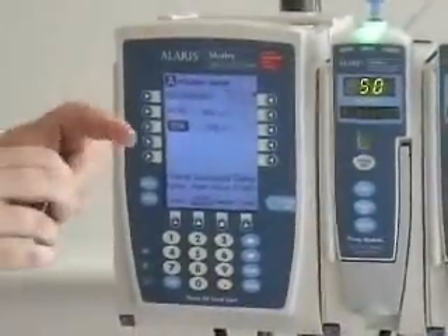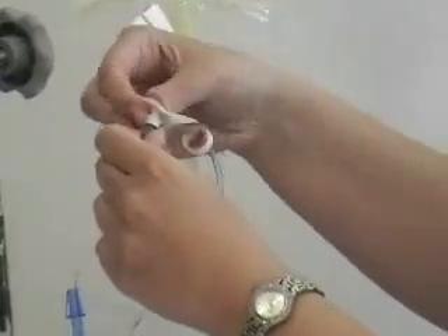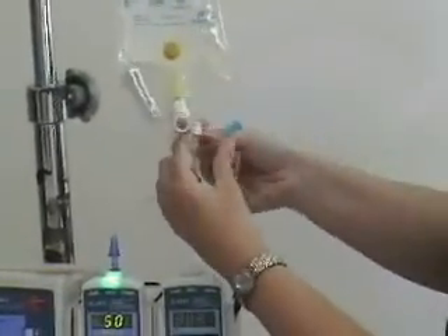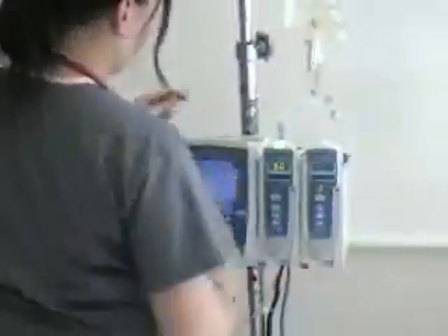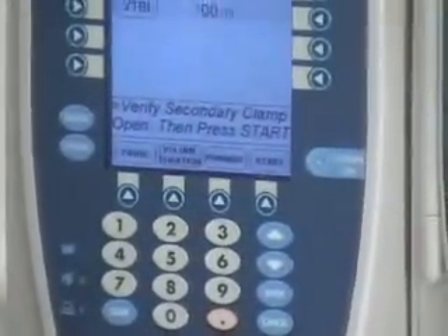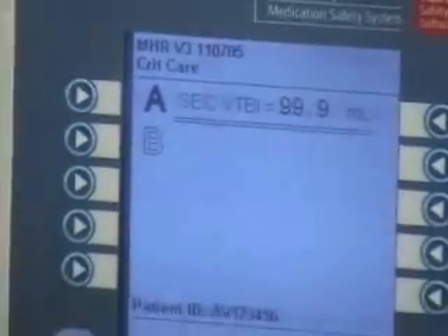First, clean the port always before you attach. This is where our secondary tubing goes — this is the end of our primary tubing. We're going to add the secondary tubing into that — just take off the end cap and put it on. Now your piggyback is all set up, everything's ready, you've got your rate in. Push start. Now it's telling us our secondary piggyback is going at 100 mils per hour.